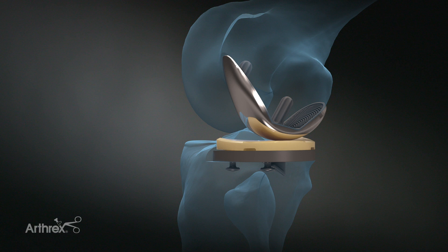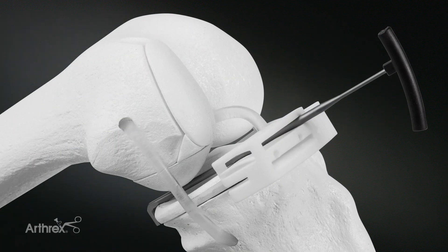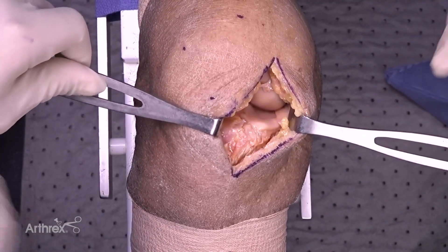Today we're going to perform an Arthrex iBalance Medial Unicompartmental Arthroplasty. We are going to be demonstrating a new tibial cutting guide. It's very unique — a disposable guide that uses patient-specific slope and depth of resection, and really simplifies this procedure to give a reproducible flexion-extension space.